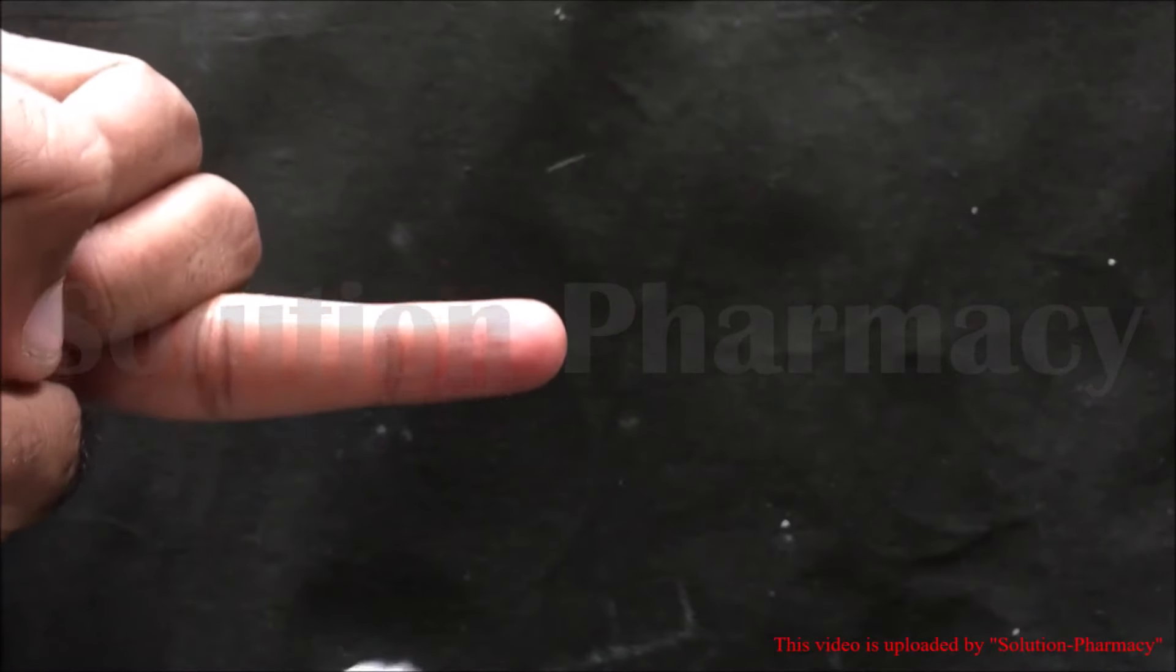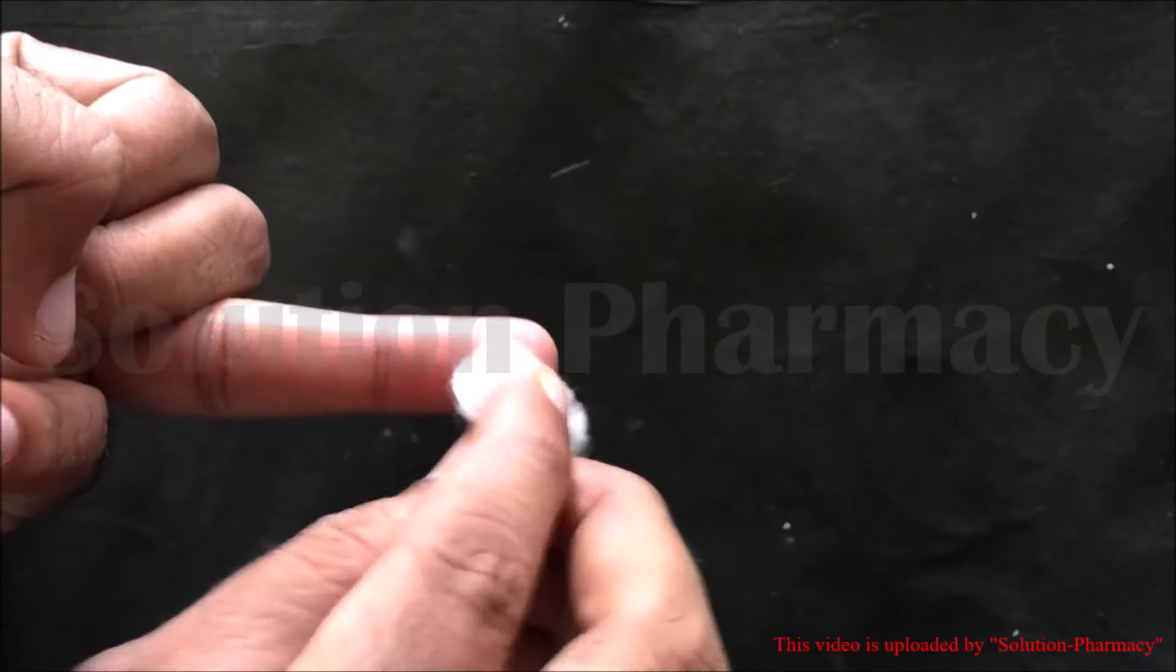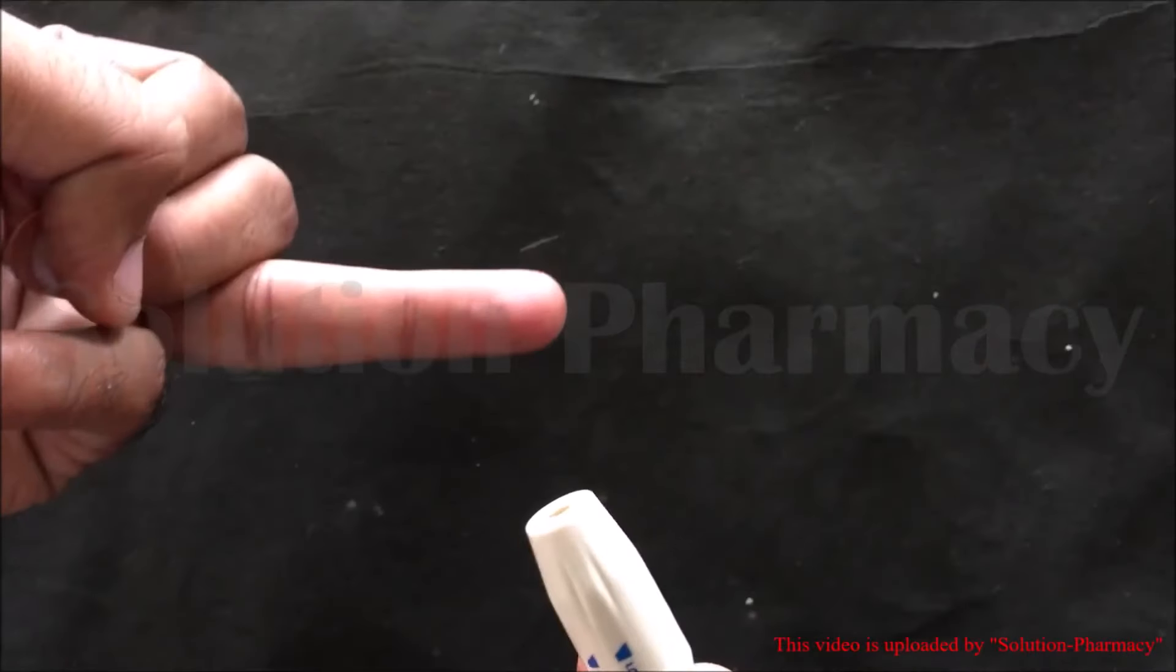First of all, sterilize your fingertip with cotton swab soaked in spirit or 70% ethanol, and then set the pricker pen depth containing sterile lancet.